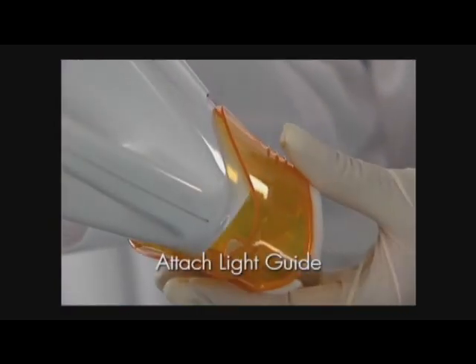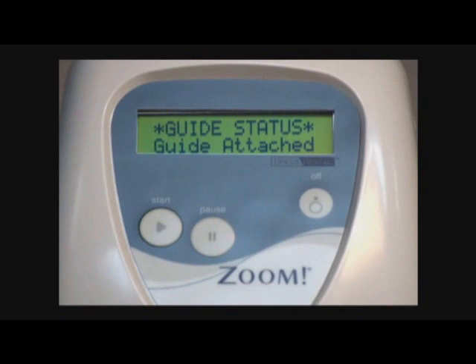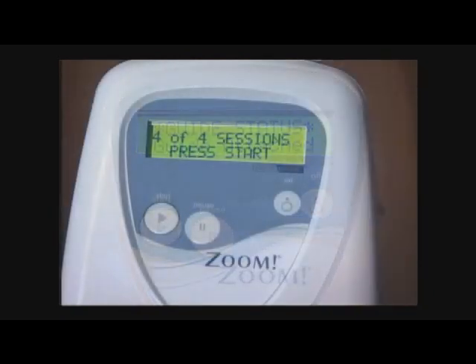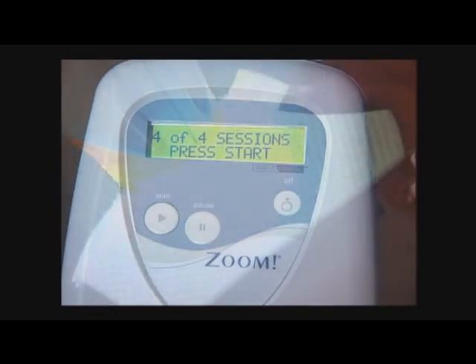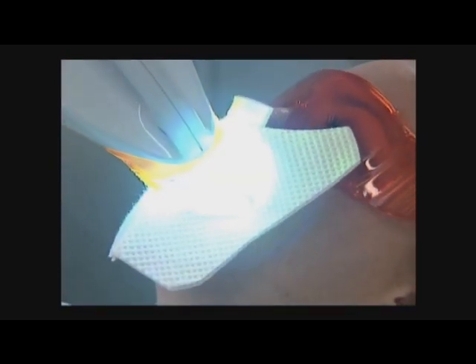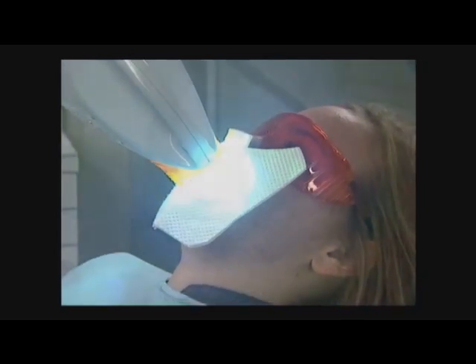Attach the light guide to the lamp. The lamp will not turn on if the light guide is not in place. The display will read Guide Status, Guide Attached when the light guide is attached, and will then read X of X sessions, press Start. The number of sessions can vary based on the kit type. The light guide is designed to ensure proper distance to the light and maintain light exposure to the smile zone.